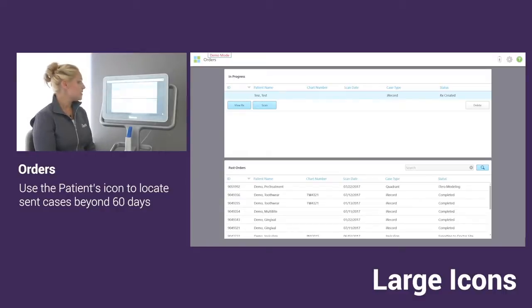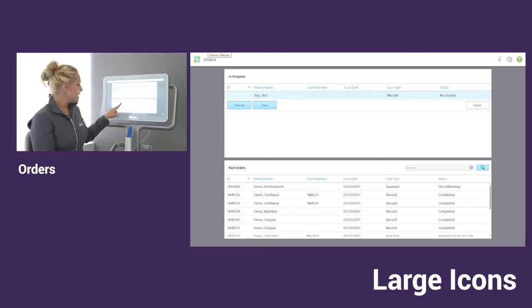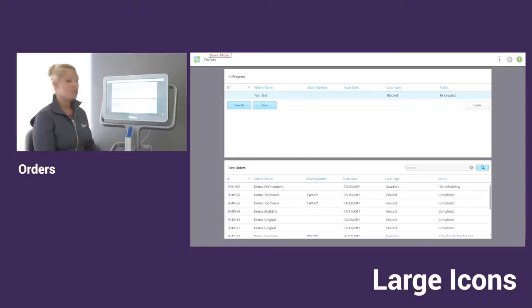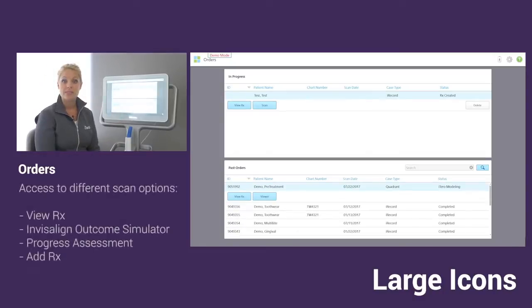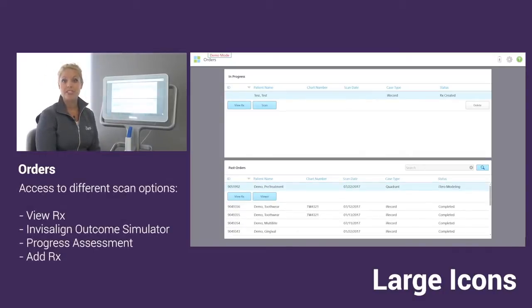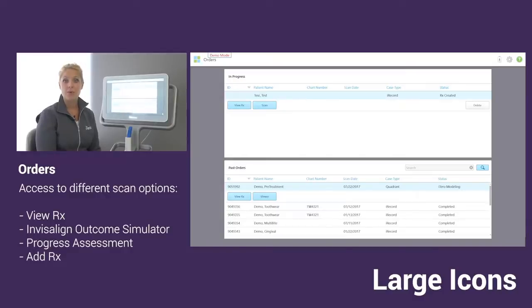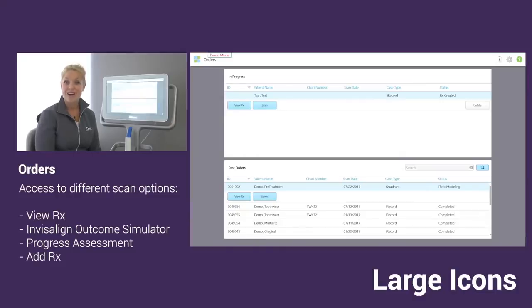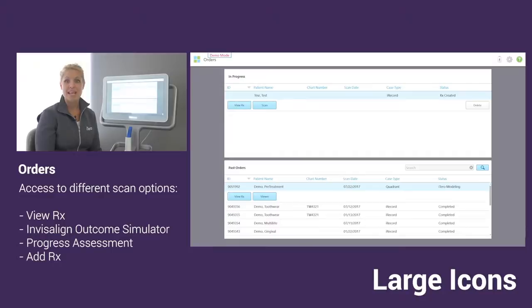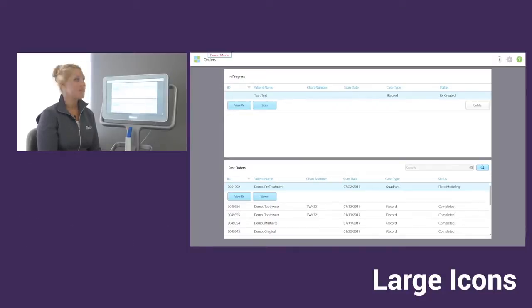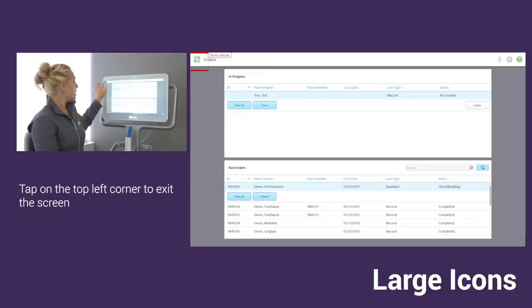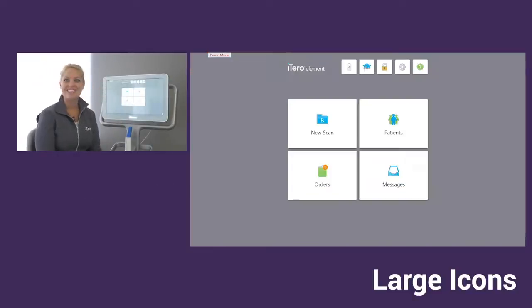With all of your cases that have been sent, we can tap on the scan and you will get all of the same options as you did when we tapped on the order in the patient's icon. So here's a second area where you can view the model, view the Rx, possibly run the Invisalign Outcomes Simulator, the progress assessment, and the ADD-Rx as well. Now to close, I can again tap on my home screen icon.